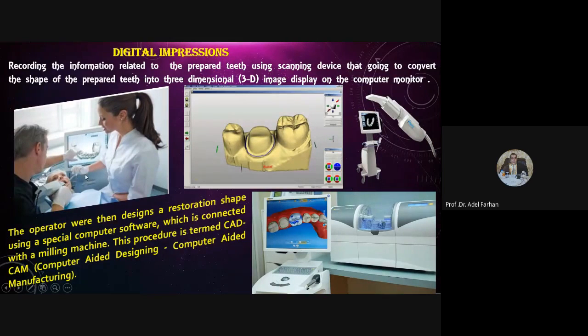After you scan يتحول الاسنان الى شنو 3D image بالسكانر. هذا راح يصير فايل داتا تخزن وين؟ بالحاسبه. بعدين لما نحتاجها بالميلينج ندفعها بالميلينج، نسوي ديزاين ونسوي له ميلينج، لان الكاد كام يتكون من السكانر و STL software where we have the machine.